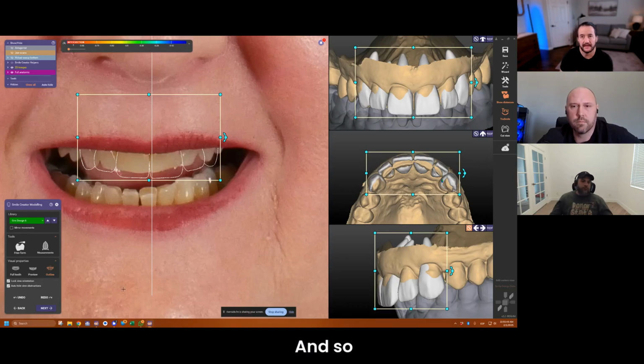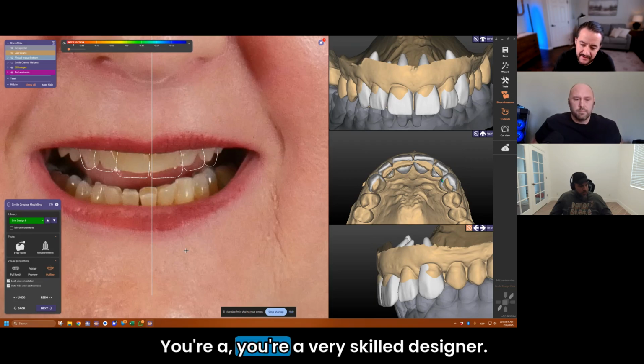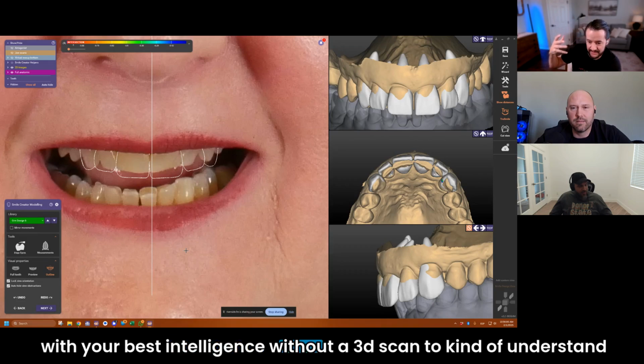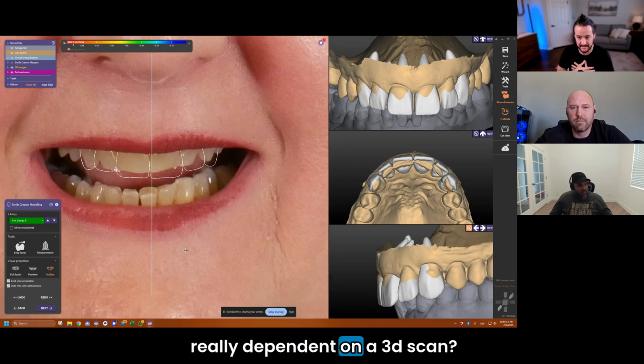Okay, let me push back on you, Daniel. You're a very skilled designer, so there's a compliment. Shouldn't you be able to take a 2D photo and, with your best intelligence and without a 3D scan, understand what some limitations are as far as moving? Or would you say you're really dependent on a 3D scan?